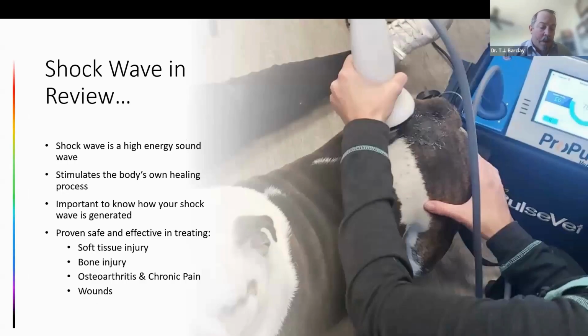So, in review, shockwave therapy is a high energy sound wave that stimulates the body's own healing processes, and both speeds healing and in some cases improves the quality of the healing process.